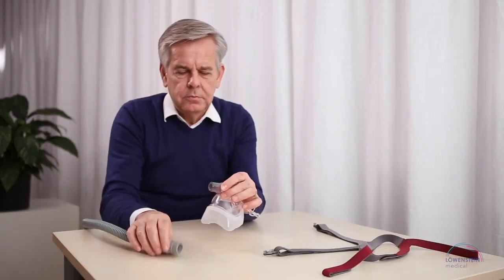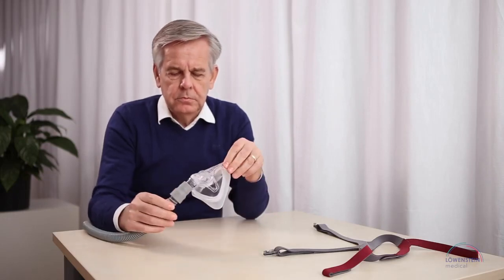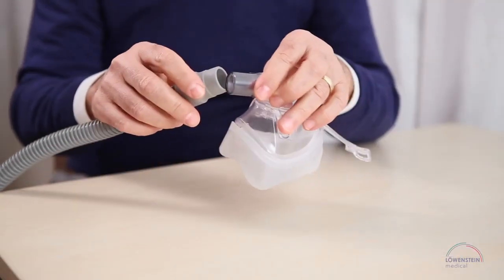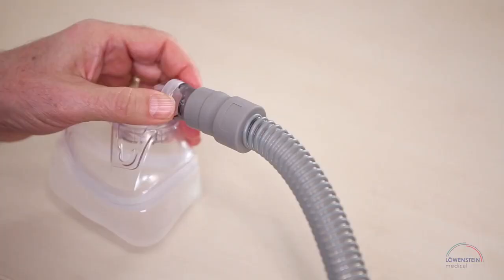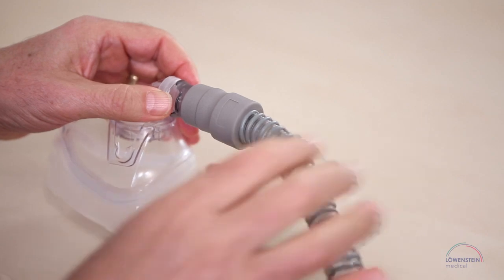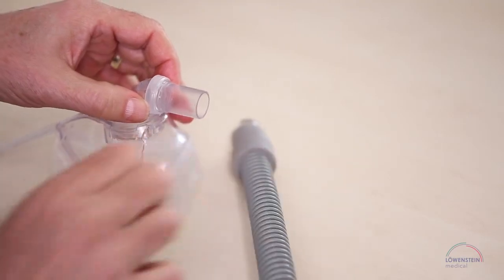If you want to connect the mask to the tube, simply push the tube onto the rotating sleeve up to the top edge. Later on, to loosen the mask from the tube, pull the rotating sleeve away from the mask.